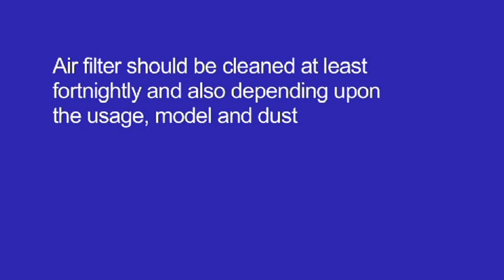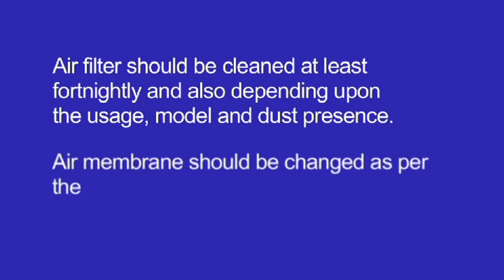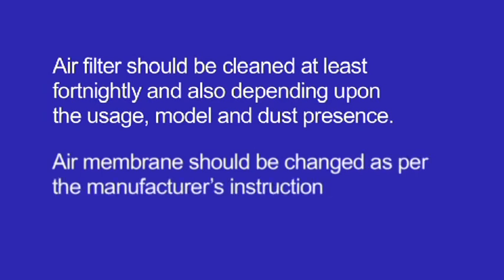Important tip: air filter should be cleaned at least fortnightly and also depending upon the usage, model and dust presence. Air membrane should be changed as per the manufacturer's instructions or at least once every year.